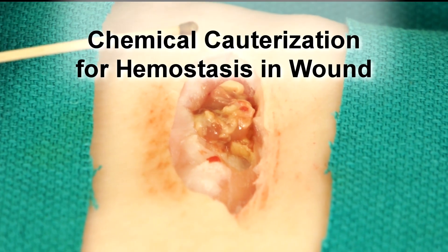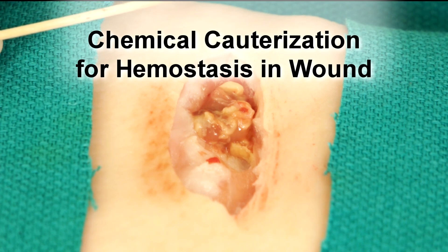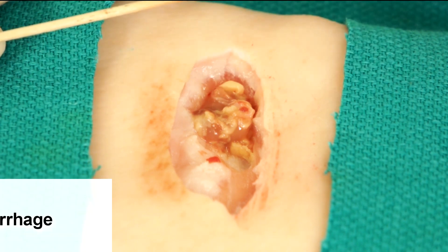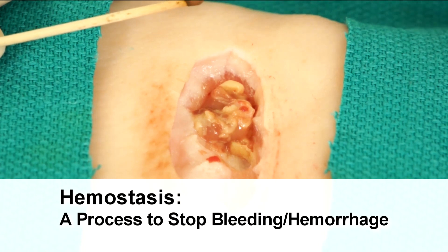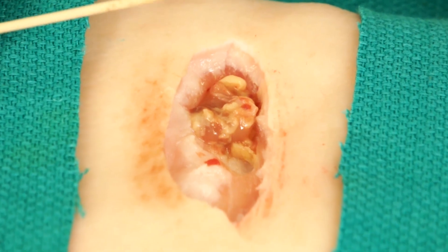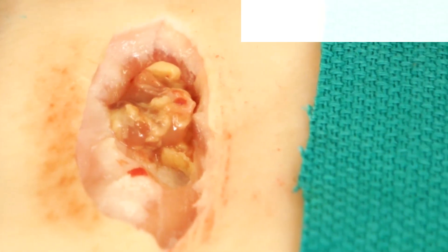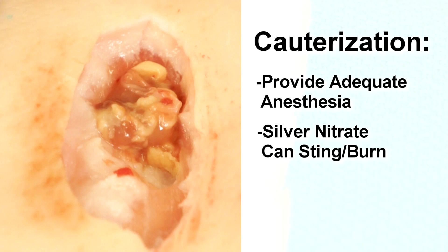This model will demonstrate how to correctly apply silver nitrate to achieve hemostasis in a wound that has recently been debrided and has a small amount of vascular bleeding that is ongoing. Silver nitrate is a chemical caustic agent and can sting slightly when applied. It is important to have adequate anesthesia present in the wound, which can most commonly be achieved with a topical anesthetic.